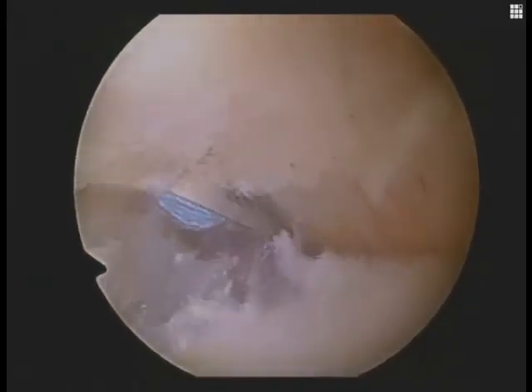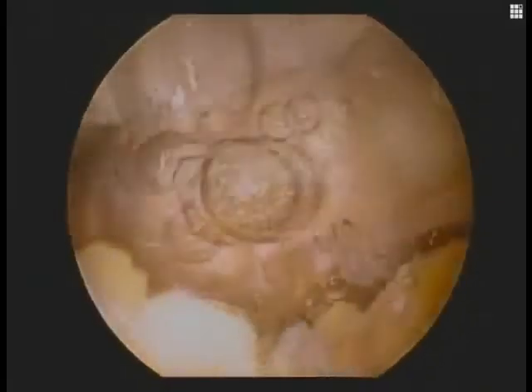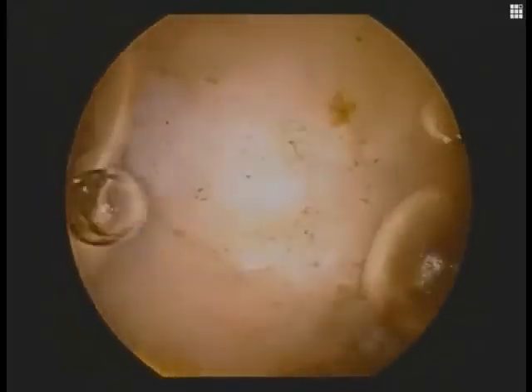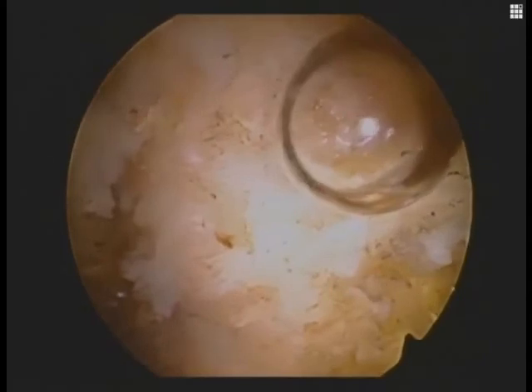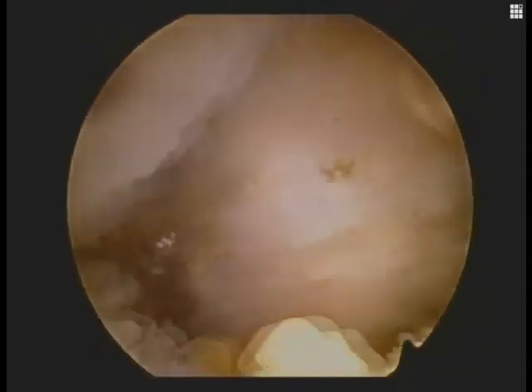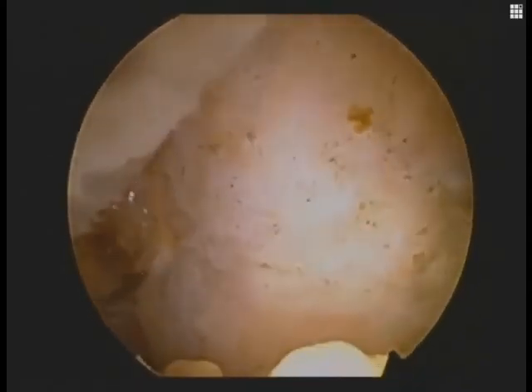We're seeing our reduced clavicle here against the posterior subacromial portal. We have abutment of the distal clavicle and acromion, so we'll eventually perform a distal clavicle resection after tying down our construct and securing our graft with an interference peek screw.